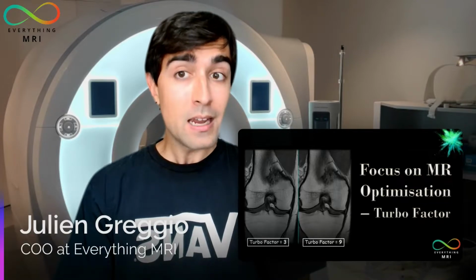Let's find it out immediately, but first, what do we mean by the term turbo factor? In turbo spin echo sequences, the turbo factor, or sometimes called echo train length according to the manufacturer we rely on, defines the number of 180-degree refocusing pulses that are performed in every single repetition time. This parameter has a key importance since it basically determines how much we can speed up a TSE sequence compared to a conventional spin echo.